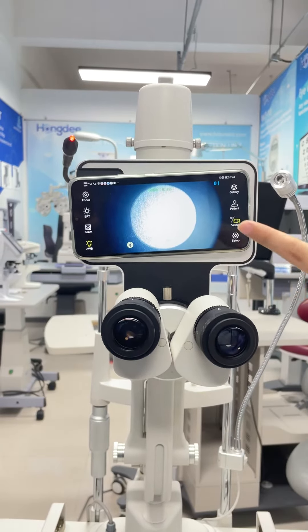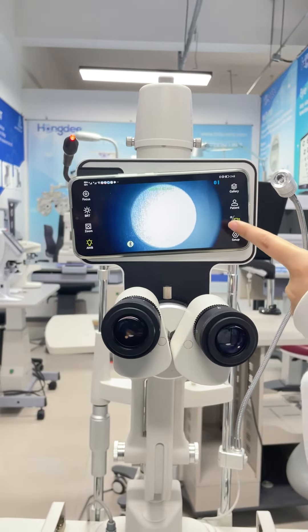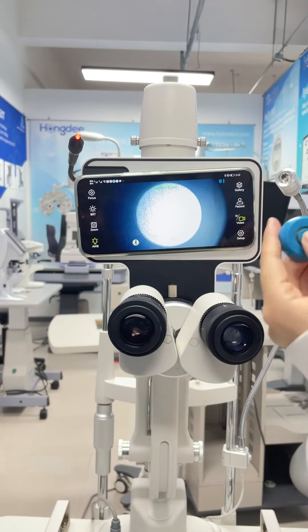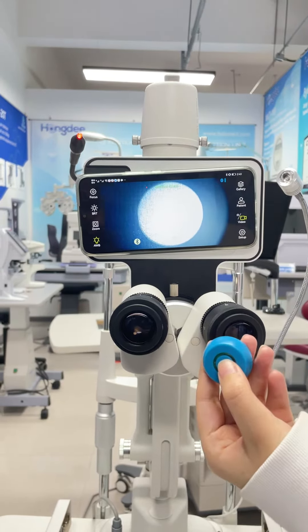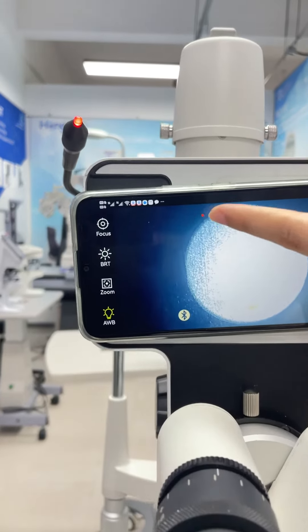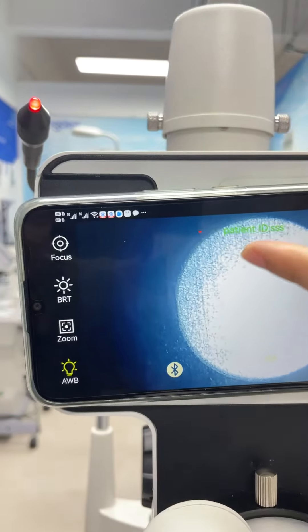And of course you can switch to video mode. Press this button. You will find there is a red flash light on the top.